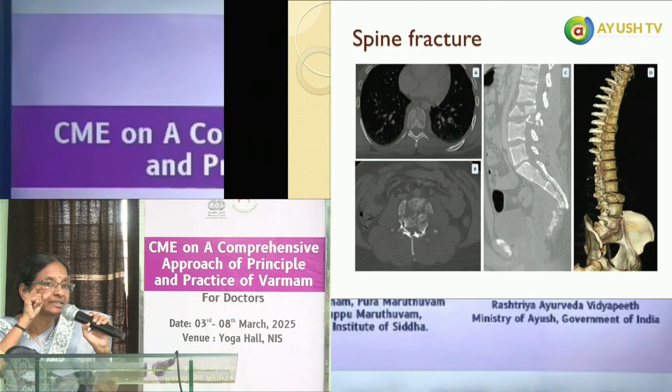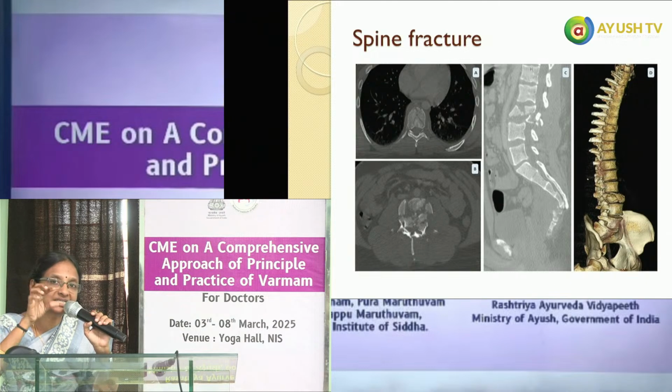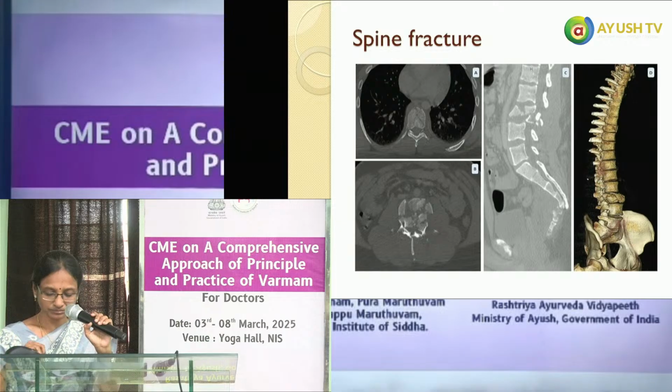So the L3, the third lumbar vertebral body, ஒரு 3-4 pieces that it has been broken. So this is fracture of L3, best picked up. இந்த மாதிரி குட்டி குட்டி fragments and extent of the injury best evaluated with the CT scan. So spine injuries, best evaluation will be with the CT scan.